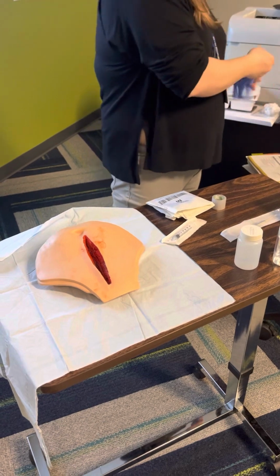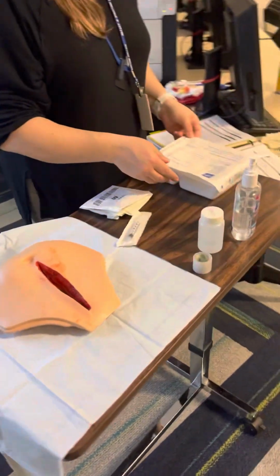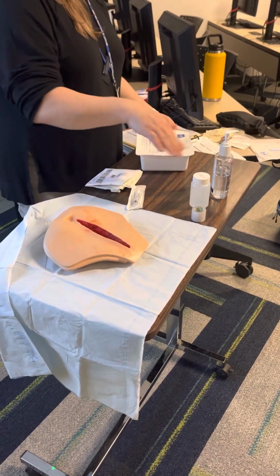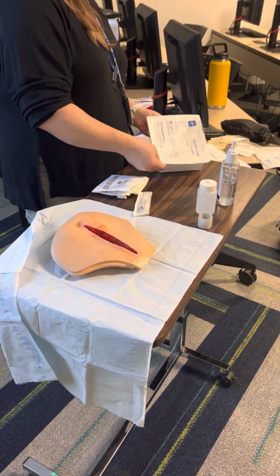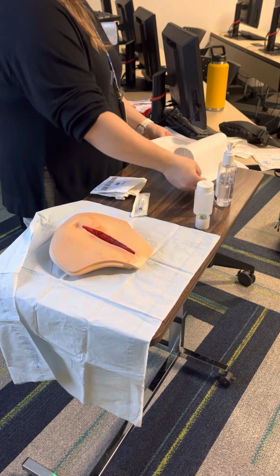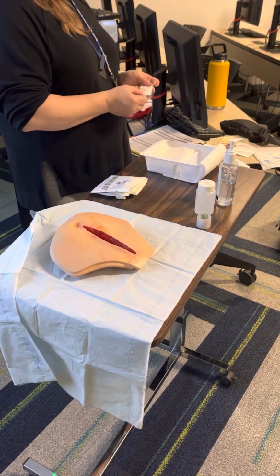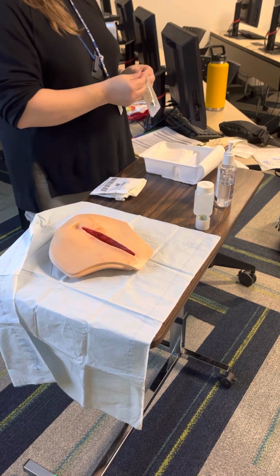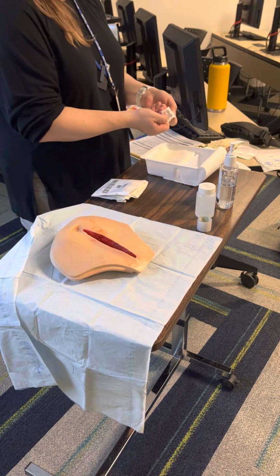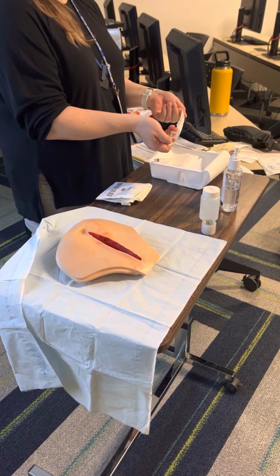I'm then going to look at my sterile package on my surface that I'm going to be using. I'm gonna make sure that it's not expired. I am going to make sure it's on a flat, dry surface. I am going to open this up with the flap away from me. I'm gonna pick up the syringe in the package, again, making sure it's not expired. I'm going to peel it without touching it. I'm gonna peel it away from myself and drop it inside the kit.